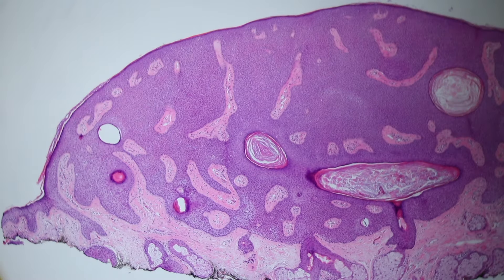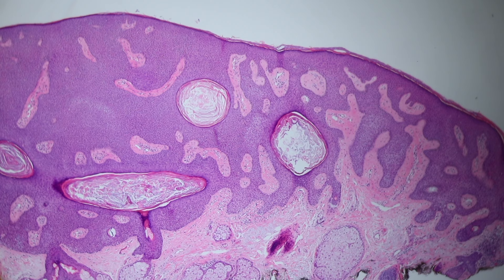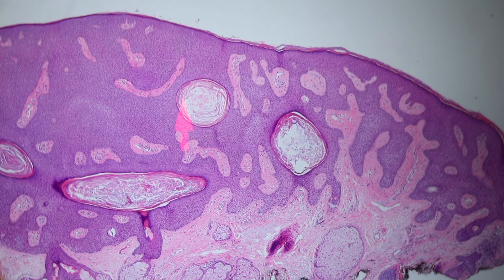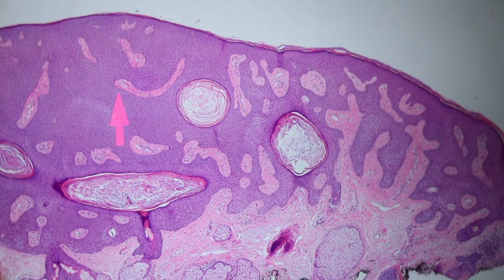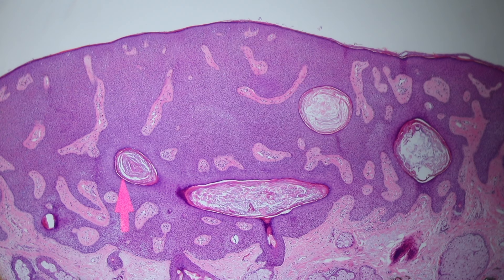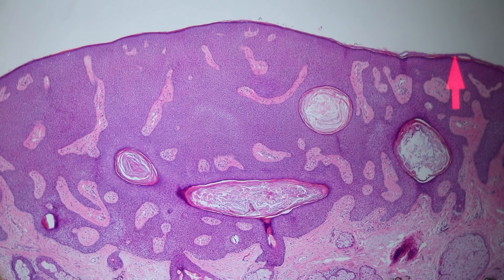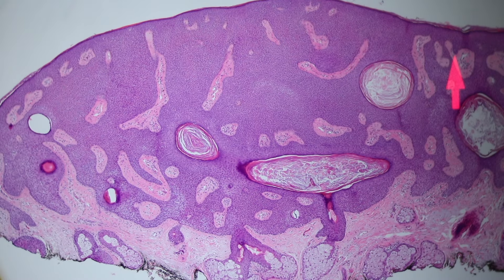Sometimes they can clinically look like melanoma or other melanocytic lesions. Here's another cut from the same lesion showing the thickening of the epidermis and horn pseudocysts filled with orthokeratin. If you start seeing dense pink keratin with retained nuclei — parakeratin — in the middle of these pseudocysts, you have to consider the possibility of a subtle squamous cell carcinoma. Squamous cells tend to make little keratin pearls with parakeratin in the middle, not loose orthokeratin. When seborrheic keratoses get inflamed or irritated, they can also make parakeratin in those horn pseudocysts, so you don't want to use that as a hard and fast rule.